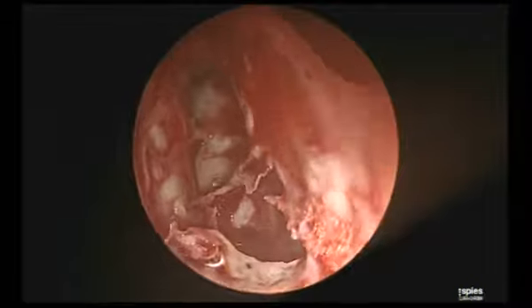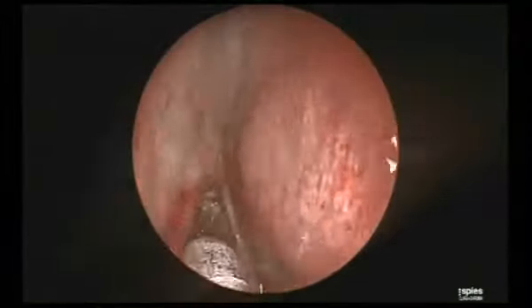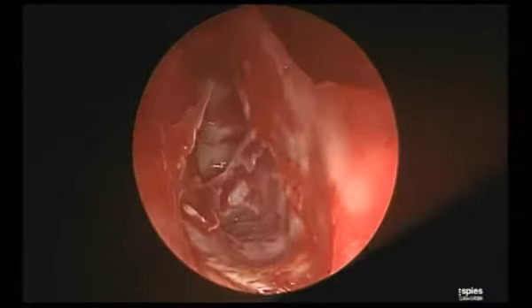Clean it a little bit. Artery, that is the artery. See that? That is the artery. Can you see or not? Let me change the angle. Okay, again. Can you see the artery behind now? Yes, we can see it. Yes, very nice. Clear? Now, again, I'll make it clear.